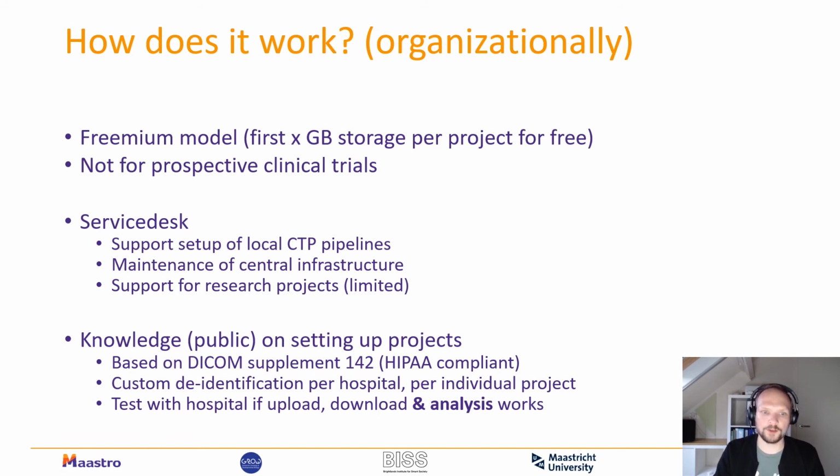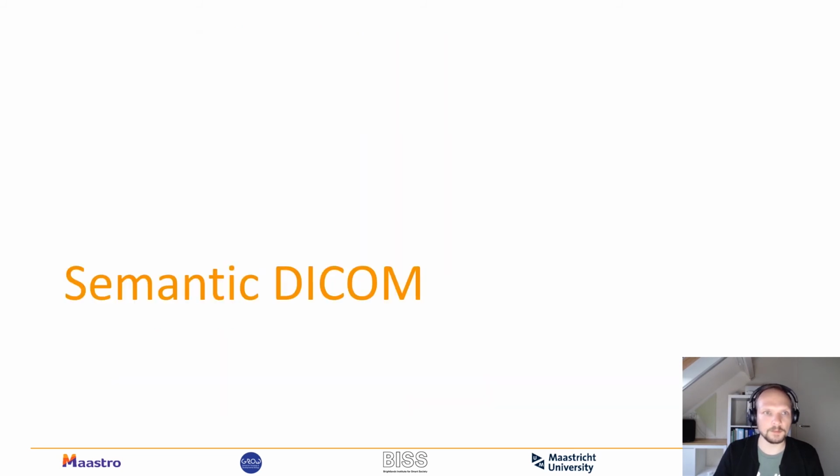Furthermore, the custom de-identification is done per hospital and per individual project, as mentioned before, to make sure that it works and is correct for that specific project. And finally, as mentioned before, we test the whole pipeline from front to end with the researcher before giving the green light to really start the research project.